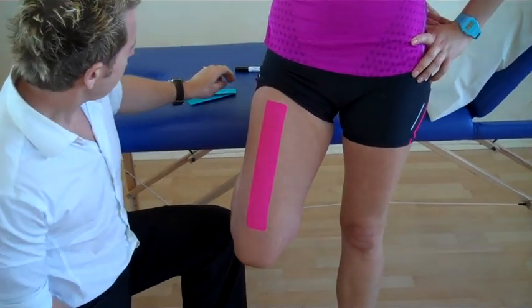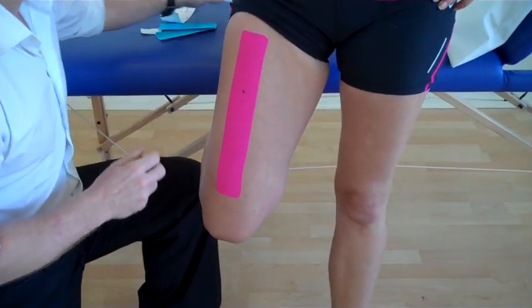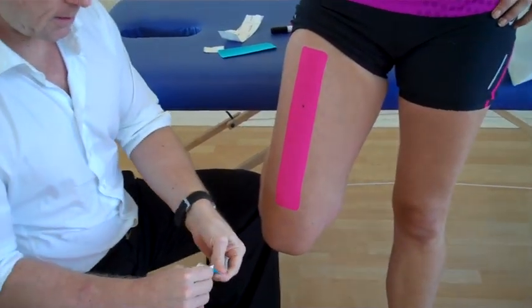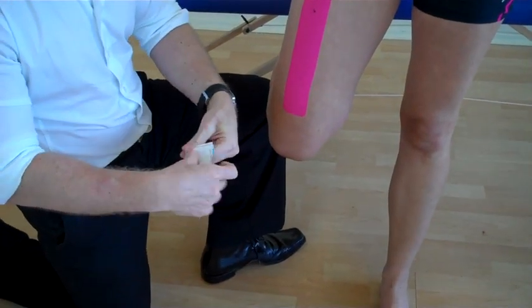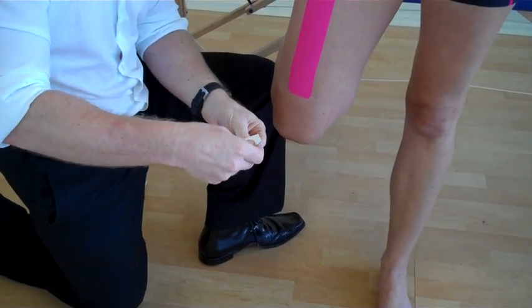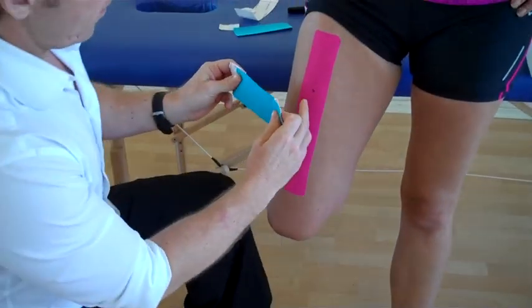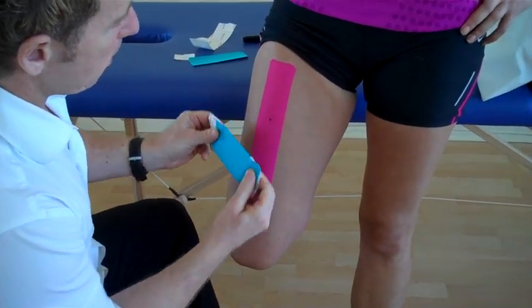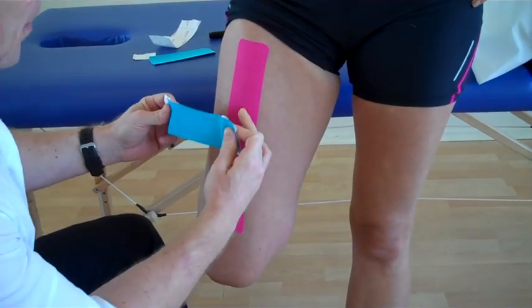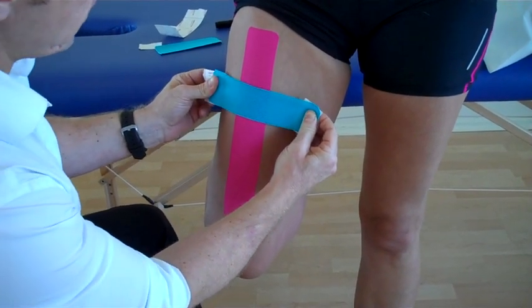So think about where the pain was located, around about this area. Now what we're going to do is use two smaller I-strips — splits in the center — peel back and hold on, and peel back. So the ends are no stretch. And what we've got now, where the actual pain is located, we're going to apply an X-shape strip using the two I-strips over that area.